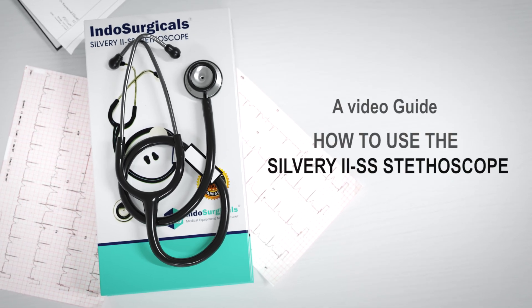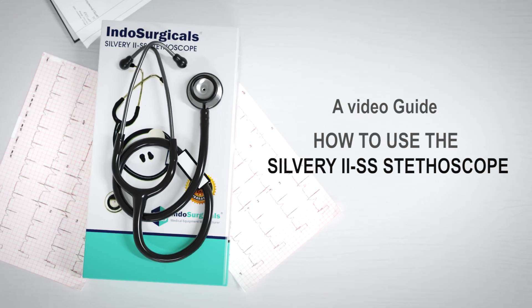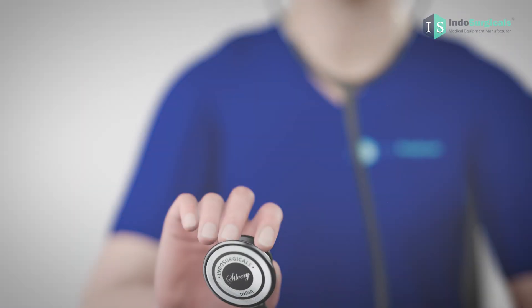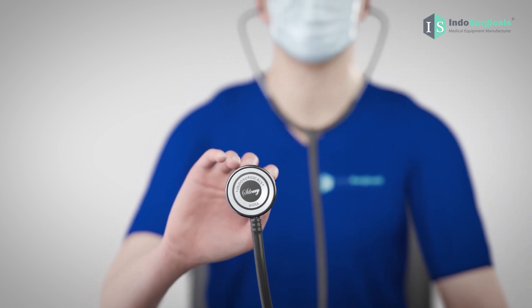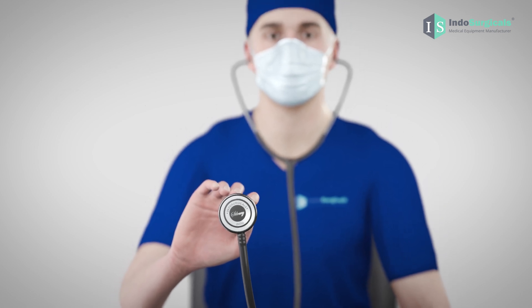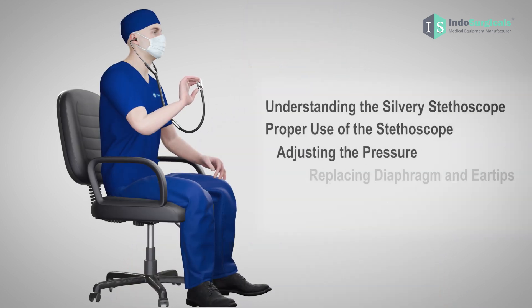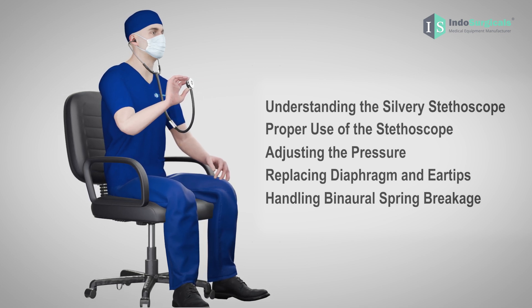This is a comprehensive video guide on how to use the Indosurgical Silvery Stethoscope. We understand that many new users may face challenges while using a stethoscope, such as difficulty in hearing sounds clearly. Before assuming that the product is defective, take a few minutes to watch this video guide to ensure proper usage.